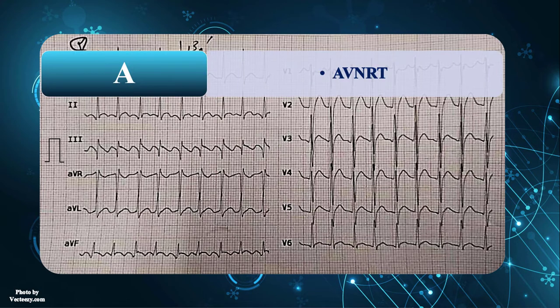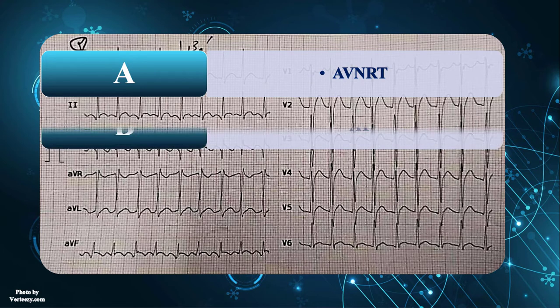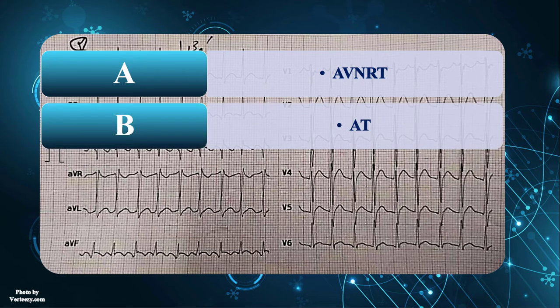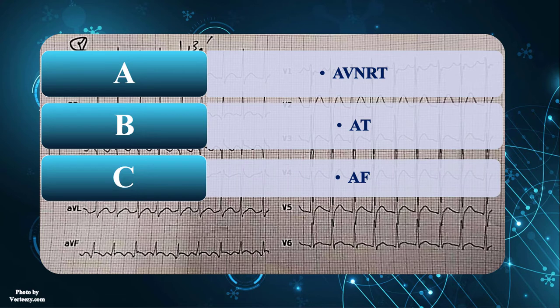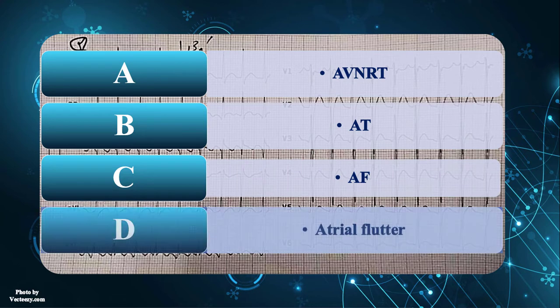Which of the following is the correct answer? 1. AV nodal reentrant tachycardia. 2. Atrial tachycardia. 3. Atrial fibrillation. 4. Atrial flutter. What are you going to do for this patient?